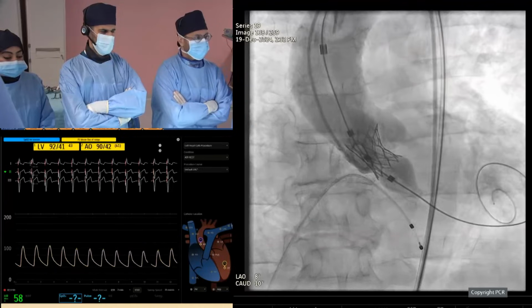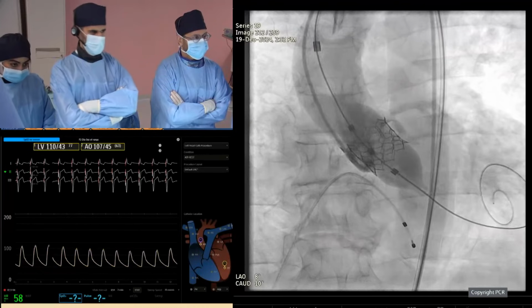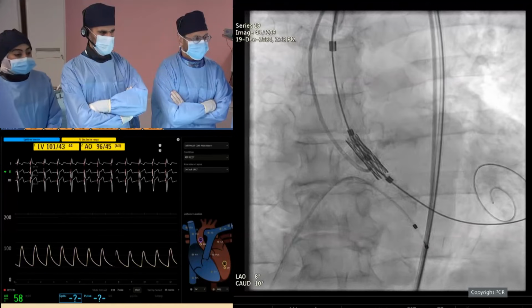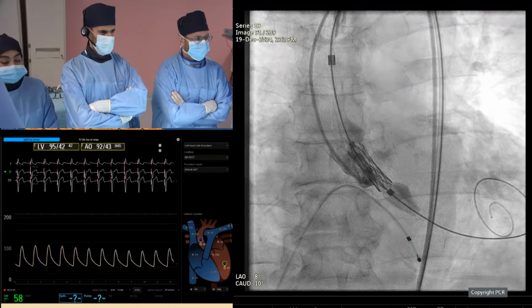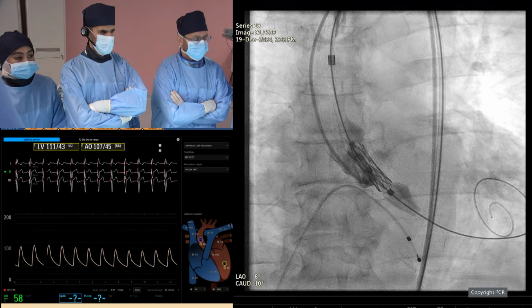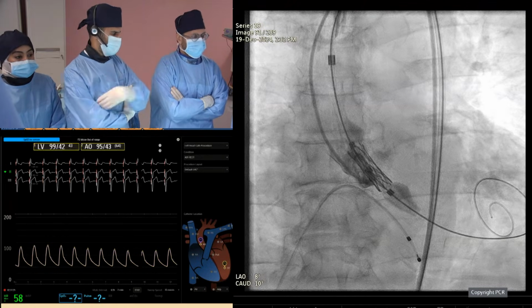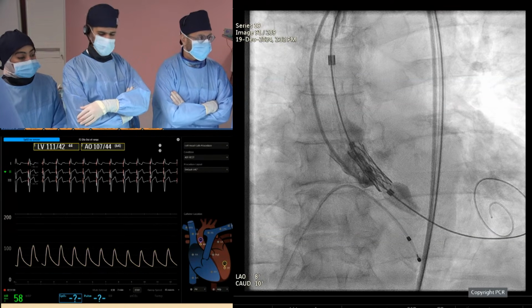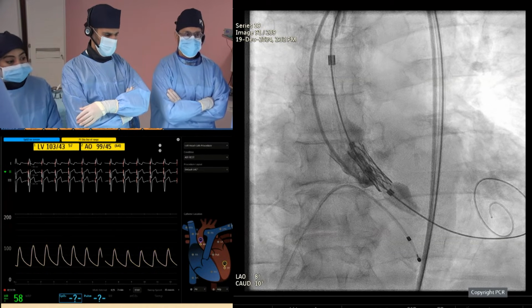You were 80-20, and it's certainly in this projection that you're doing, and you were expected to be ending up at 90-10 or pretty much 0. Actually, it looks 80-20, but you have to eliminate the parallax before you say 80-20. Very important, because as long as there's a parallax, you are a little bit deceived. Sure, yeah. So to understand where we landed exactly, we could try and do one more injection in the implantation view, modify it to remove the parallax, and see exactly where we are.